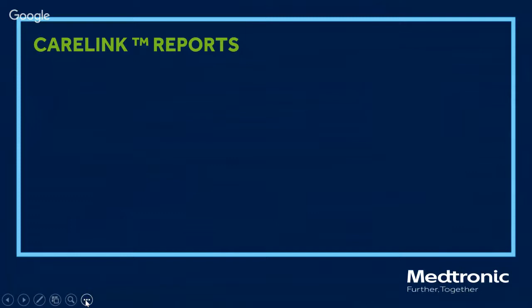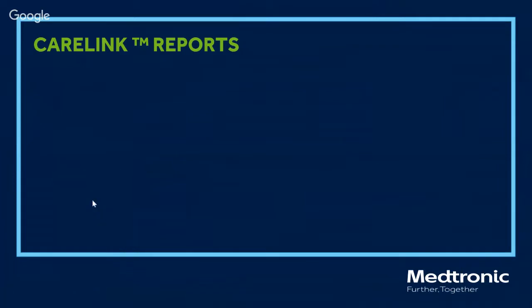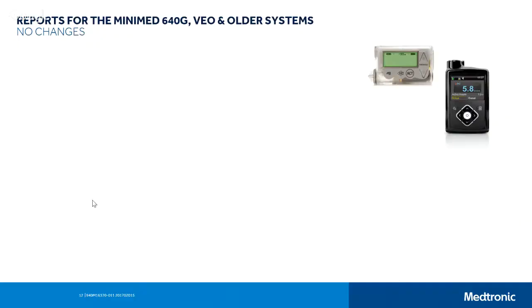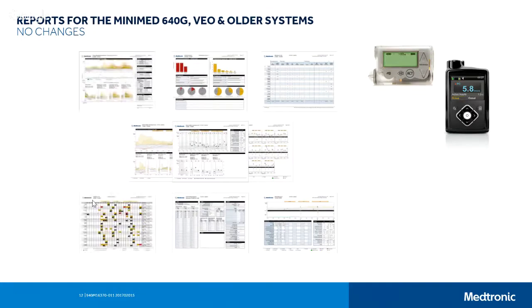Okay, so I'm just going to go through these. It's important to note that the CareLink reports for MiniMed 640, for the VEO, and for the older systems won't change. Therefore, the therapy dashboard, the adherence report, the sensor and meter overview, logbook, device settings, and daily detail will all still be available for these models of insulin pump, and therefore your interpretation methodology can remain unchanged.